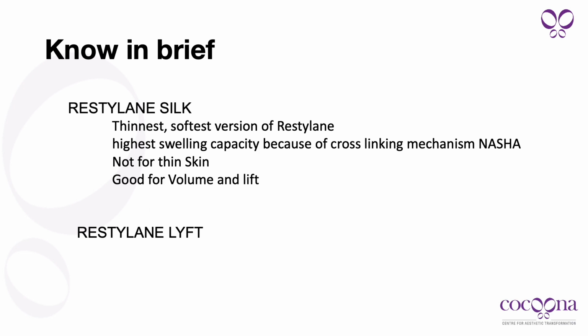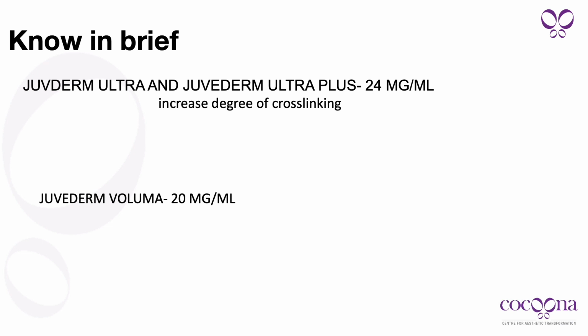Although it is thinnest, I still feel it is good for deep injection or for lift, where you want to use it in the subcutaneous plane in thicker skin individuals. Whereas Restylane Lyft, of course, is large gel particles. It was Restylane Perlane in the past and can be used for deeper layer injection.